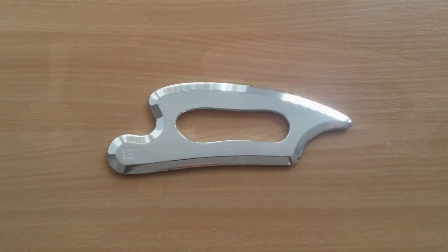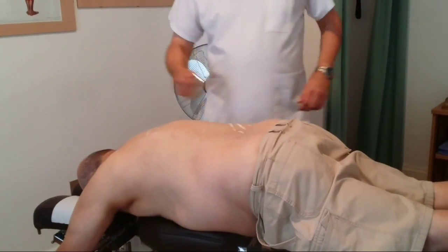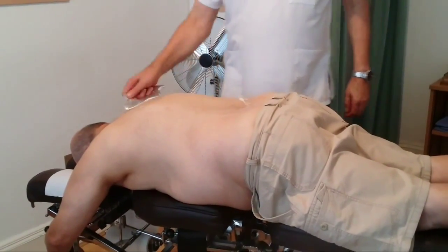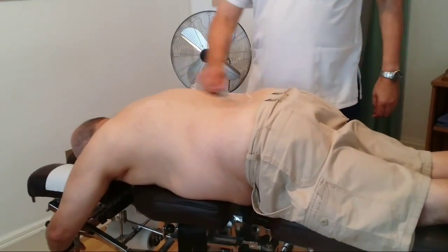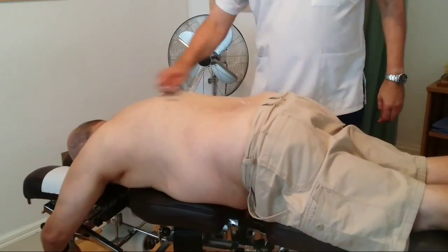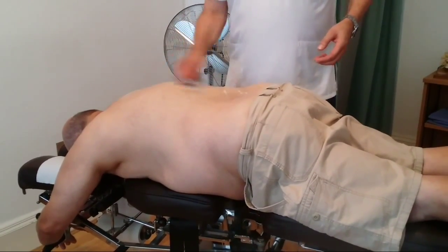Your muscle memory used in the throwing action is the same muscle memory you use with the primary stroke with our IASTM instrument. This means less fatigue and greater motor control. The handhold allows for great dexterity and enables the instrument to be held very loosely so the hand and arm muscles aren't fatigued.